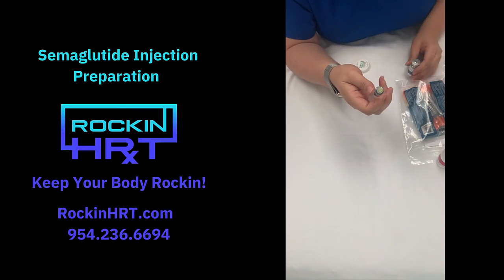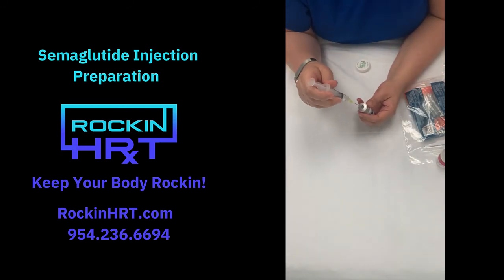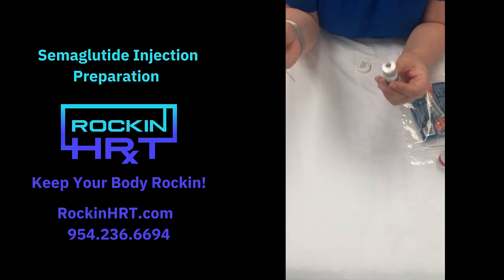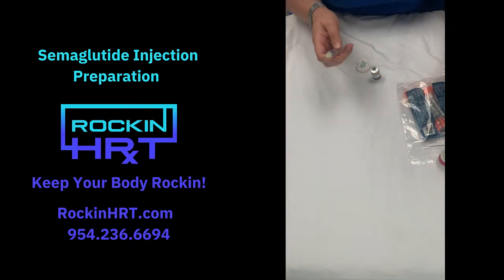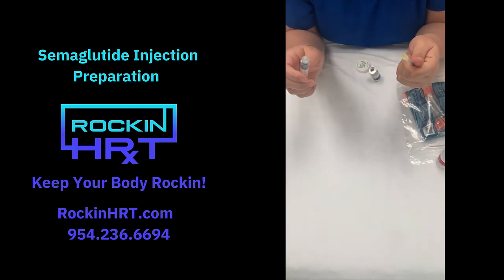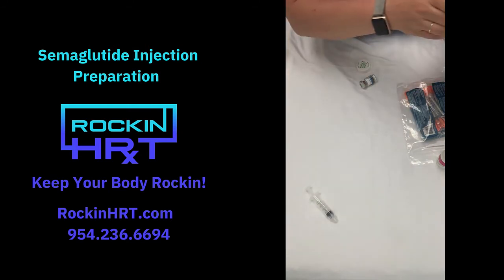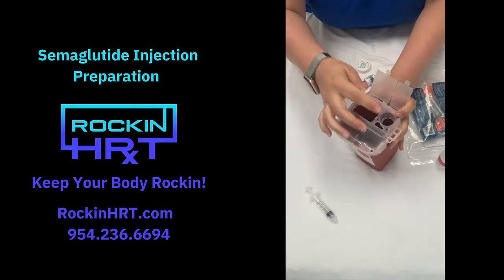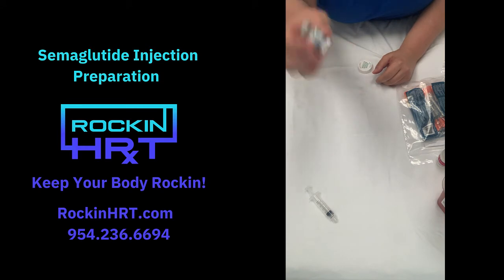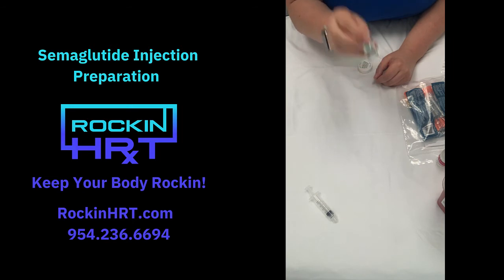We're going to take that out and then put it into the semaglutide. Let go of the plunger because the air is going to want to come back out. Then at an angle, you can put your cap back on, twist the needle off, discard the syringe in the garbage, and the needle goes in your sharps container. The semaglutide is powder in there, so you're going to reconstitute it with the bacteriostatic water and just shake it. It will dissolve very easily — you'll be able to see the bottom is clear.